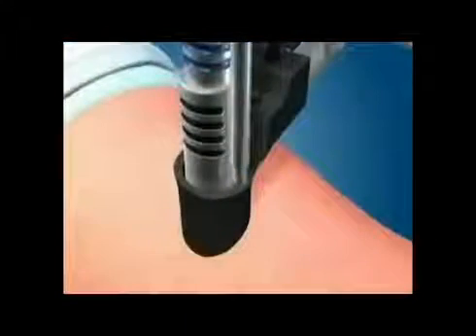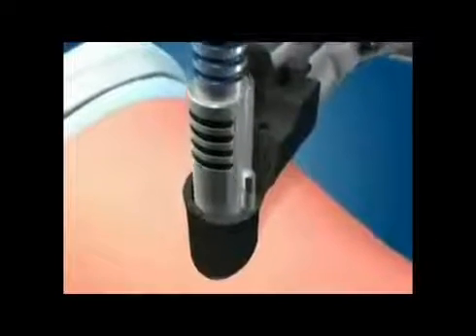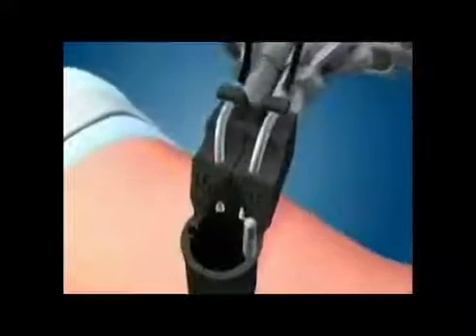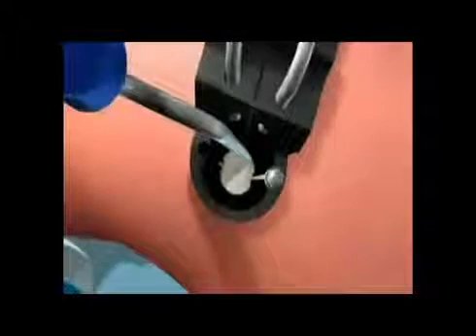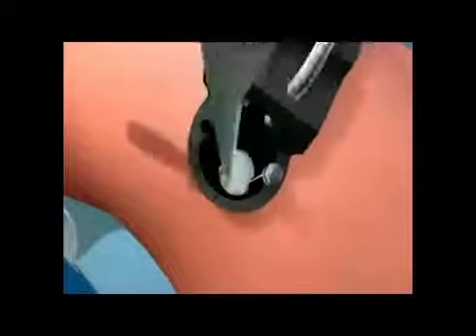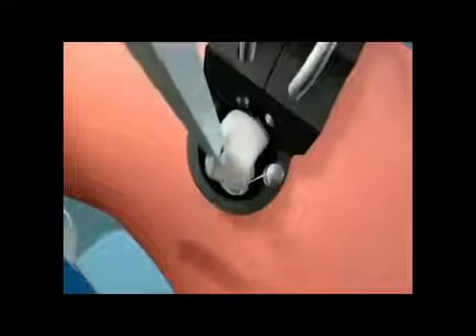A holding pin is placed in the bone to keep the viewing port in place during the procedure. A light source is added to give excellent visualization of the spine. An opening is made in the disc and the disc material is removed.